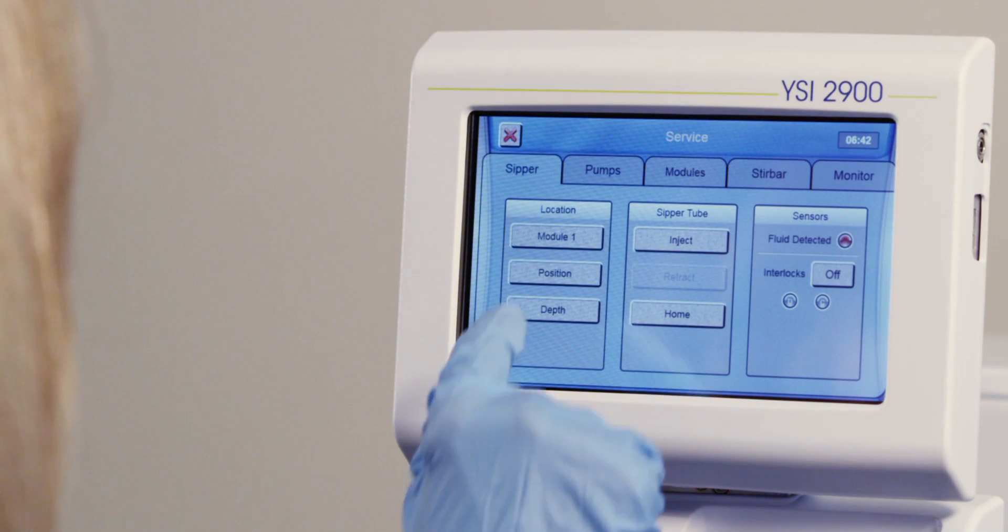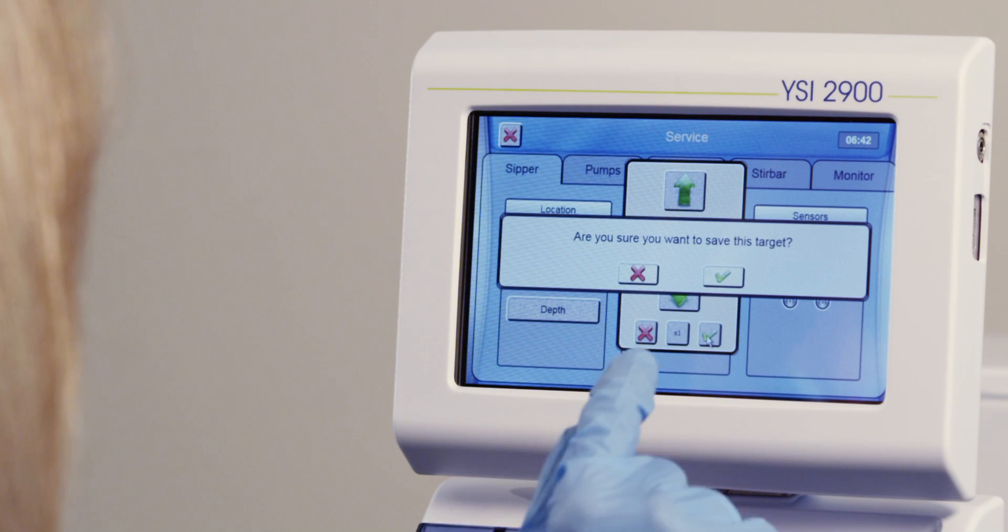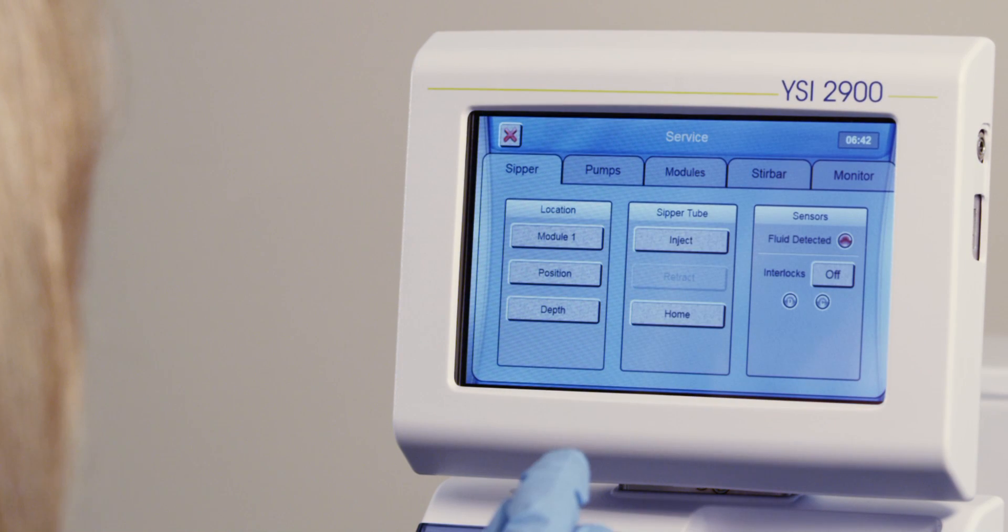Use the arrow keys to adjust the sipper so that it's centered over the top of the cone. To save the settings, press the green check mark.